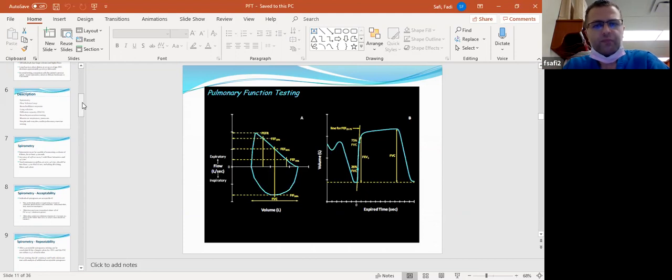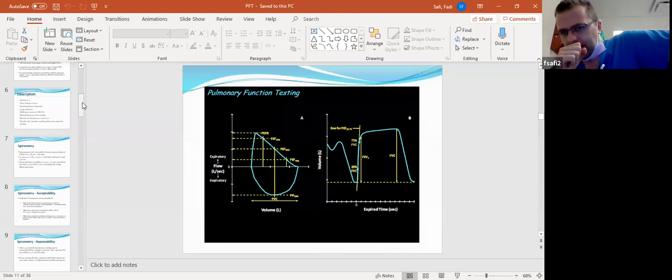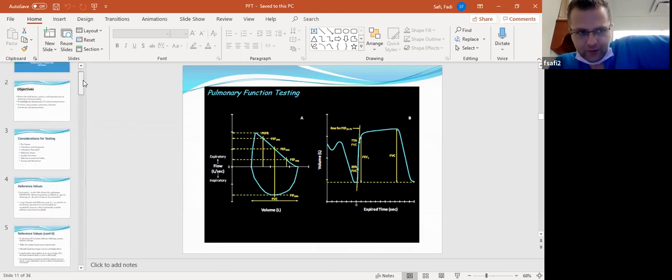There are some portable spirometers that allergists and certain clinics have in their office, and even certain employment facilities use them, and they ask you to inhale and then exhale into a device all the way until you empty your lungs. That is what we call spirometry testing. And I will explain how to interpret the spirometry and what the spirometry testing means, okay?